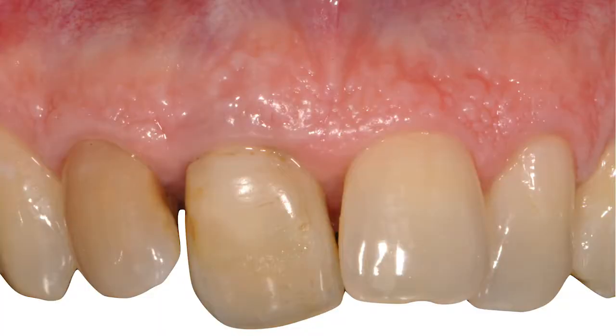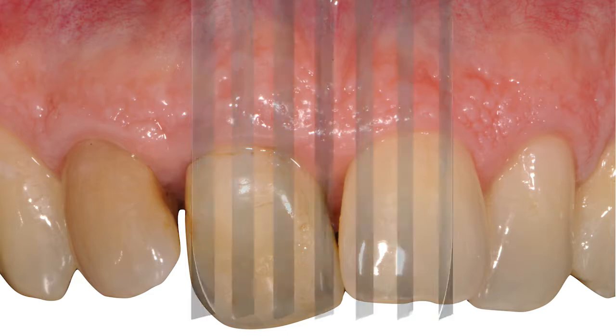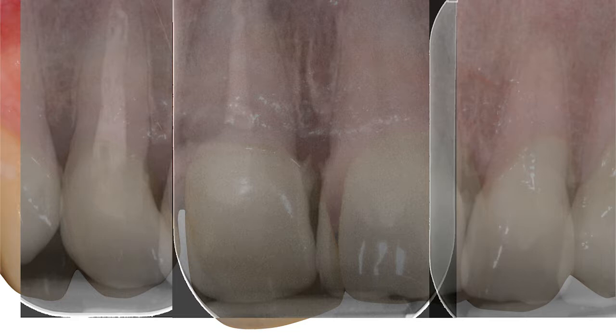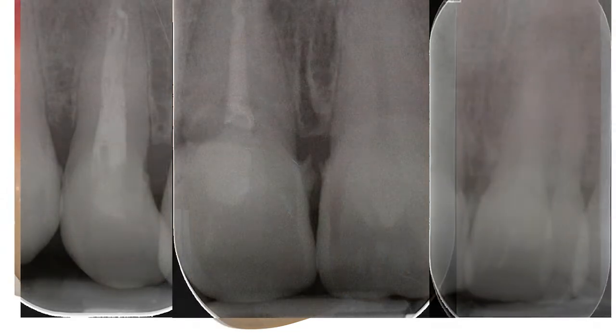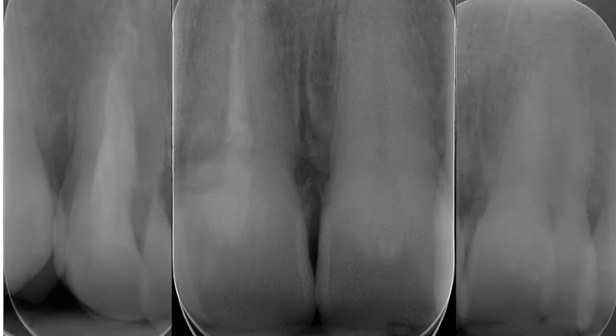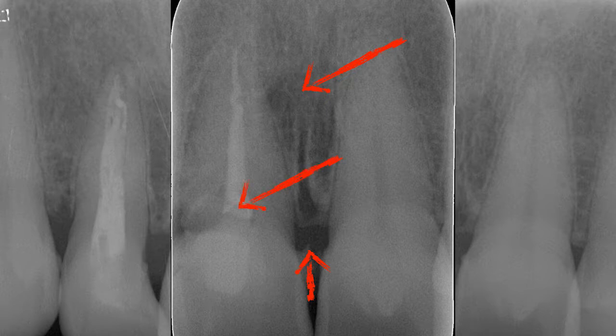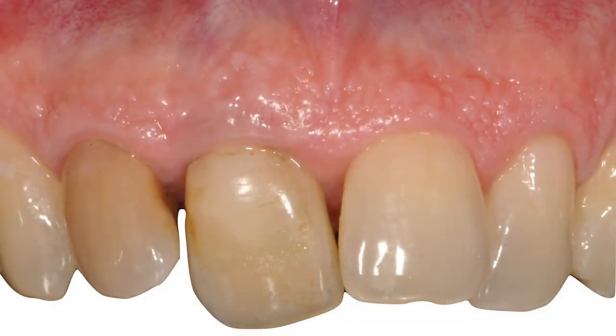This tooth was dyschromic. That's a very, very complex case. I'm going to summarize in a few slides. And there is open contact, it is lingualized. This patient had trauma 20 years before. Here we can see there are endodontic failures, endodontic lesions. This is not everything. Endodontic lesions you can see here. Very wide, large nasopalatine canal, external root resorption. This tooth doesn't have a good prognosis, it needs to be extracted.